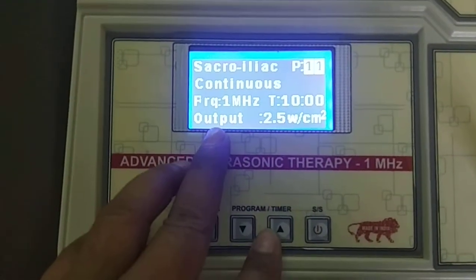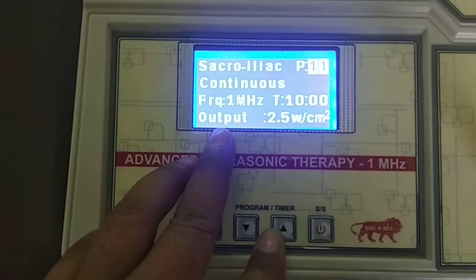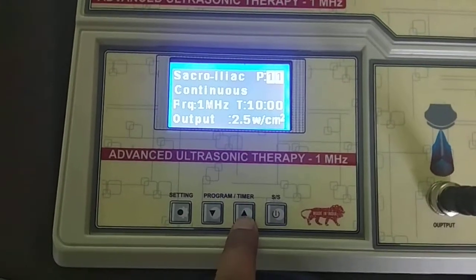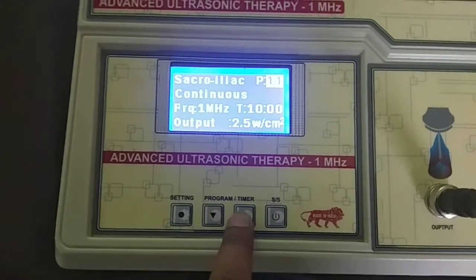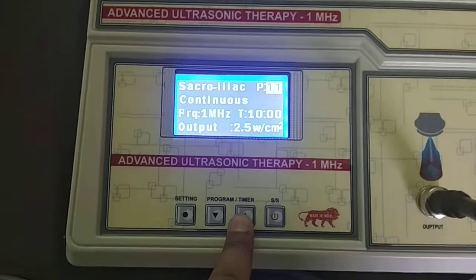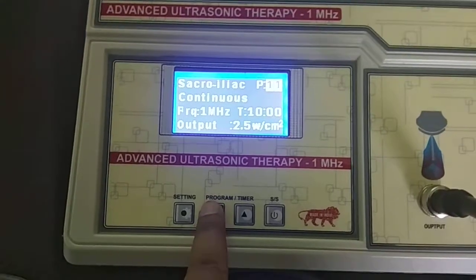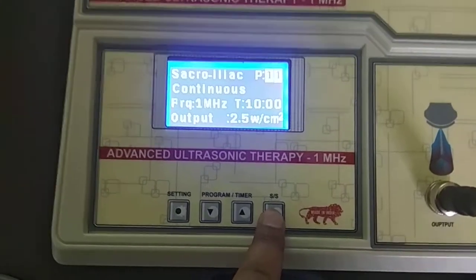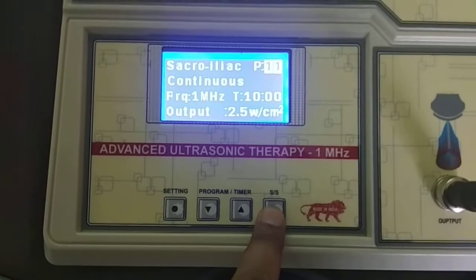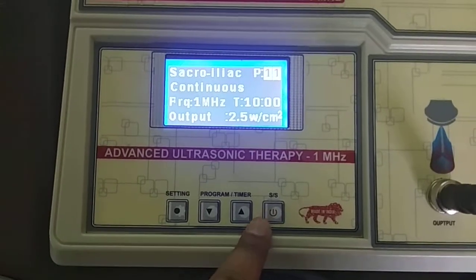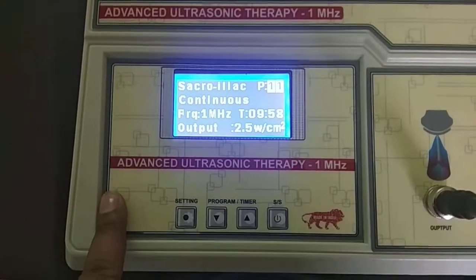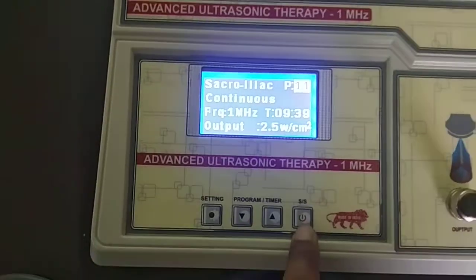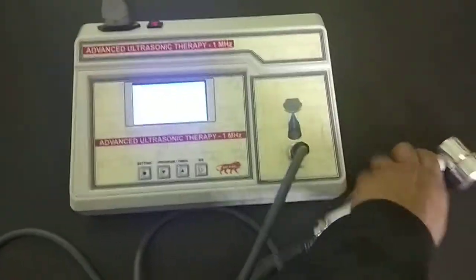You have to choose the output level by pressing these two keys — whether you want to adjust it or keep it as is. Then you can press Start. Finally the program is in Running mode.